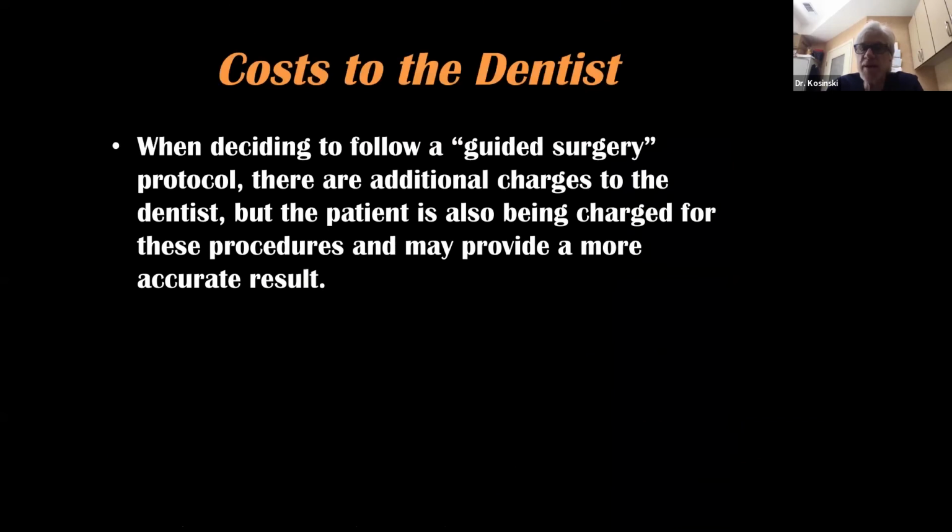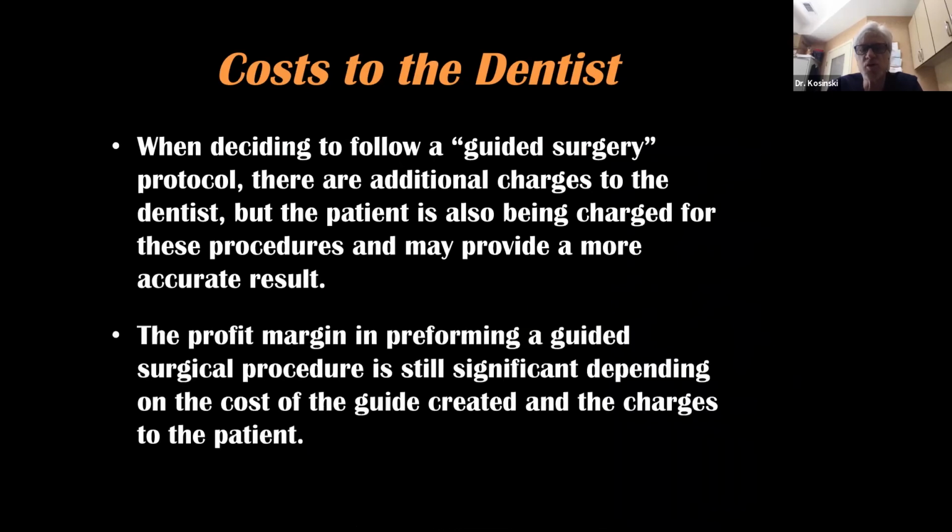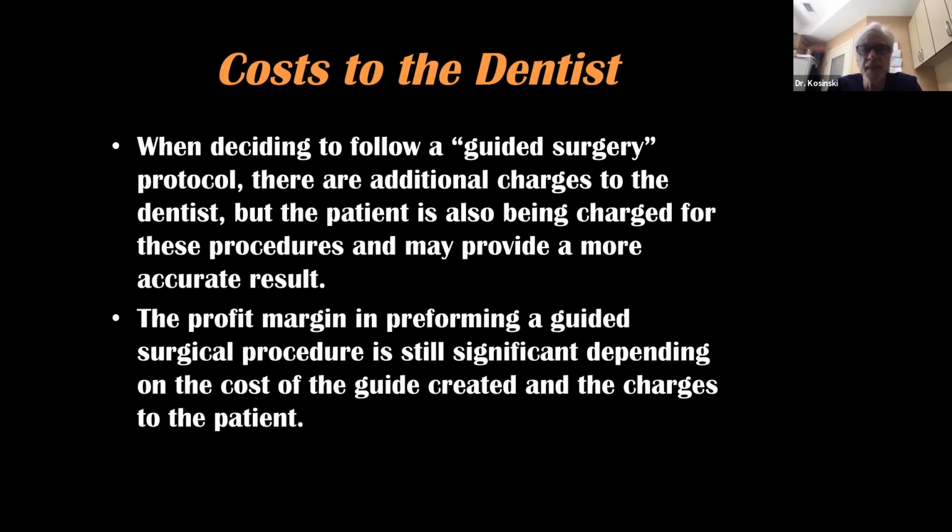Guided surgery, there's going to be additional charges, but those are passed on to the patient. And it's just going to make you more proficient and efficient. It's a tool that makes the surgical procedures go that much quicker. And the profit margin is still significant. You have the cost of the guide that you pass on to the patient, but the chair time to do these surgical procedures is dramatically decreased.